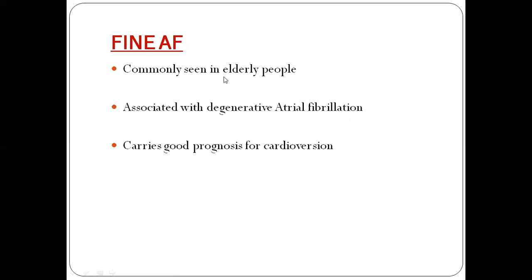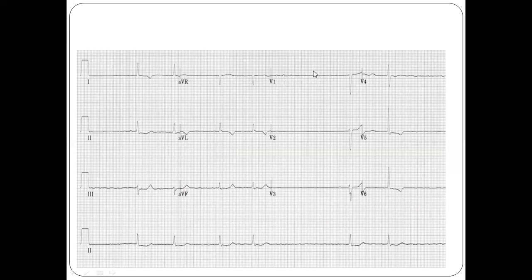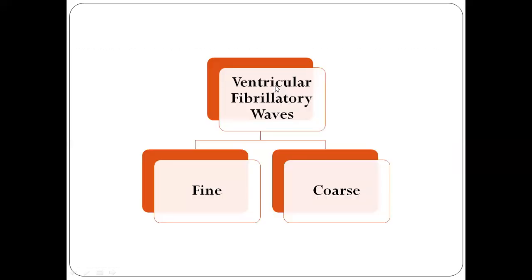Fine AF is most commonly seen in elderly people and is most commonly associated with degenerative atrial fibrillation, which carries a very good prognosis for cardioversion. If you cardiovert or start treatment, there is a high chance that the AF may revert to normal sinus rhythm. You can see here the small fibrillatory waves not even occupying one small square — that's why it is fine AF.